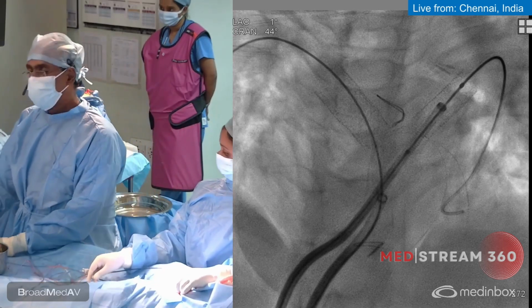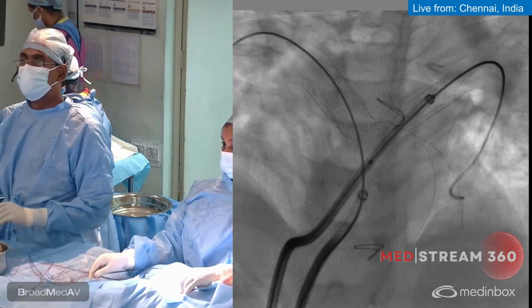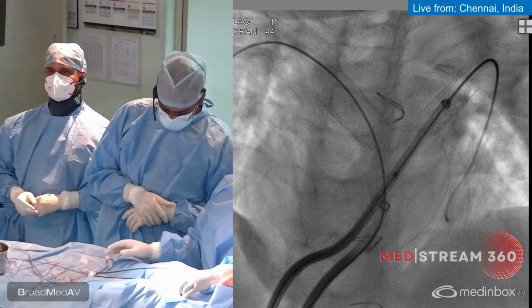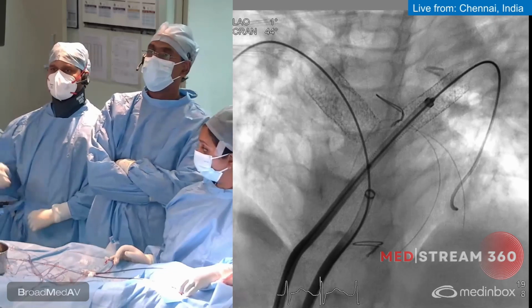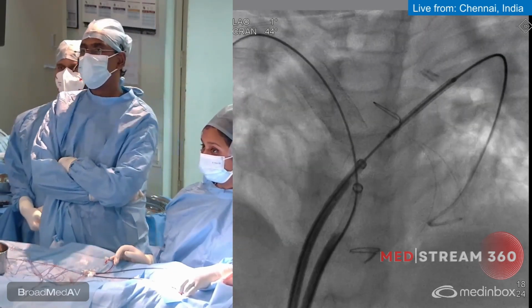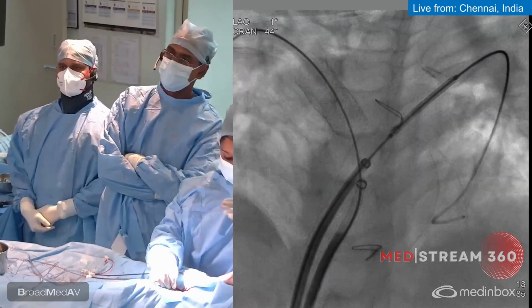So can you hold it? I'm again putting in the sheath inside. Oh, the stent is moving. Once again. Can we see whether, show the previous picture? Did we record the inflation?